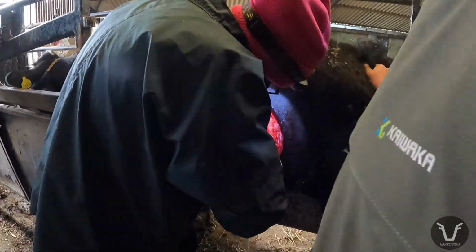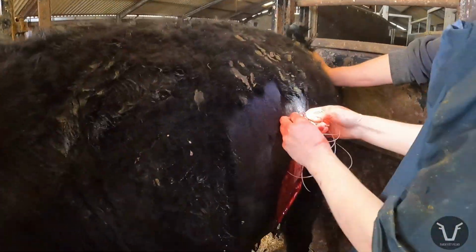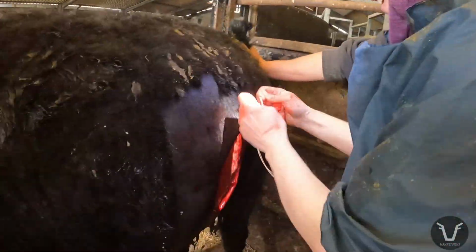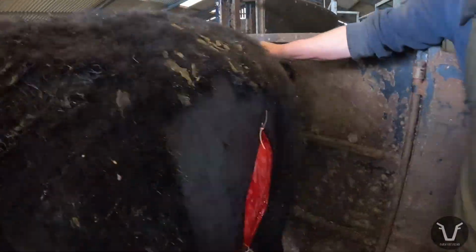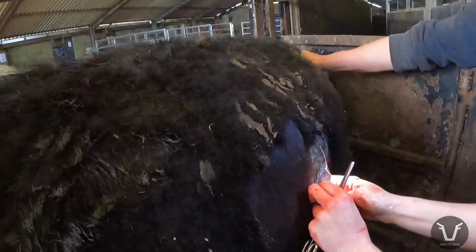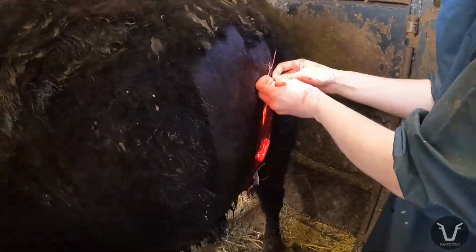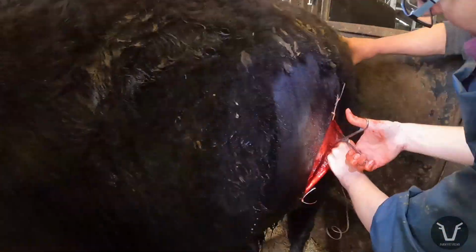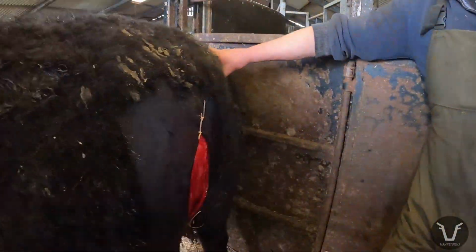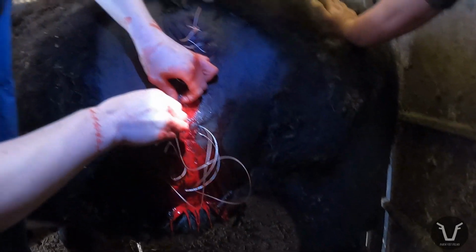As the surgeon, the honour of cutting into that mass lies with Claire. Now, what is it? The colour gives us an important clue. Coming together there. Nice. Big hole, but it seems to come through nicely.